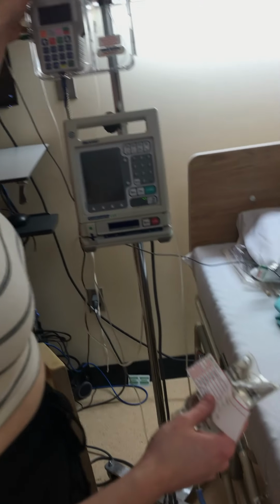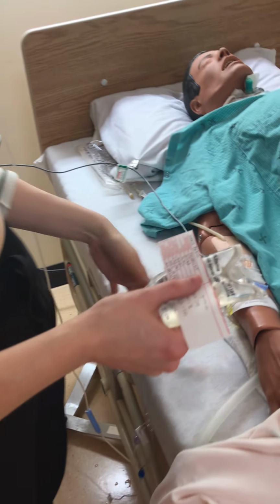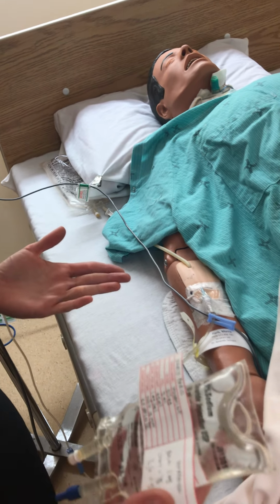You are using a PCA pump right now, or a patient-controlled analgesic for morphine. This is to control your post-operative pain. Are you familiar with this? Marcy, the patient says that she's familiar with this.